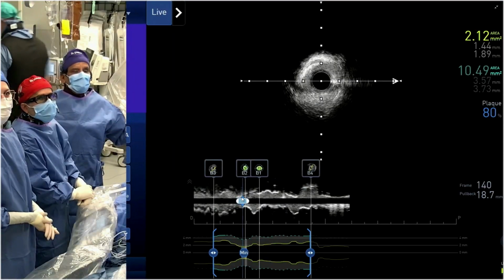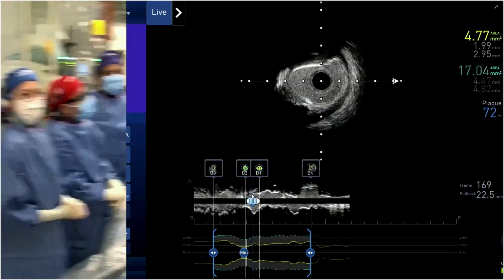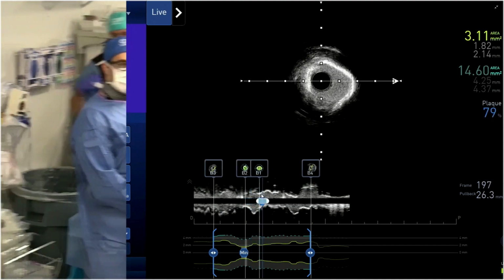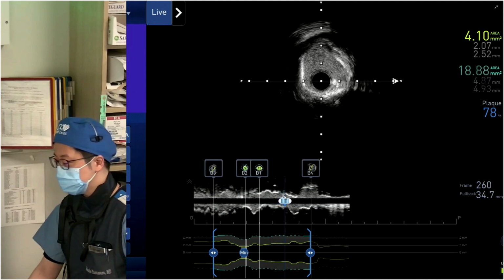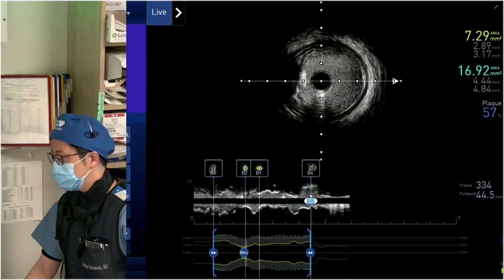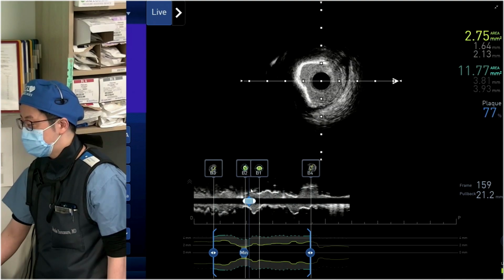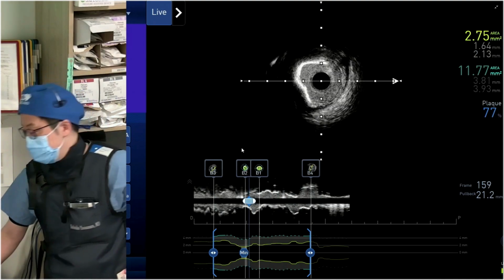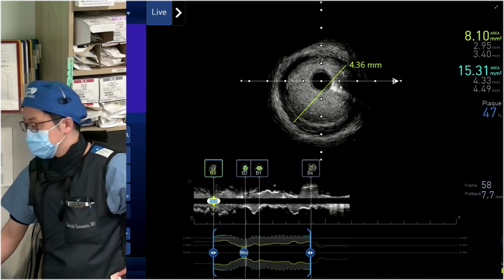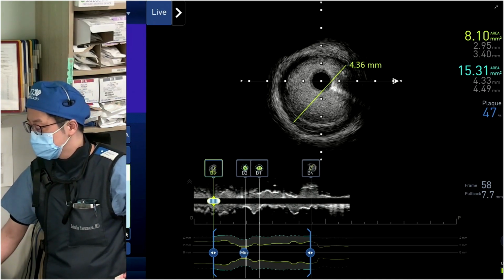Yeah, good. The mid RCA has an eccentric calcium lesion, and the proximal has a definite 360 calcium, and the distal looks like not protruding too much, but definitely severe calcium 360, and some part is eccentric, and the other half is normal. So this is the population. So what size is the vessel? The distal reference is a 4.3 vessel. Mega vessel. Lesion length is 38.